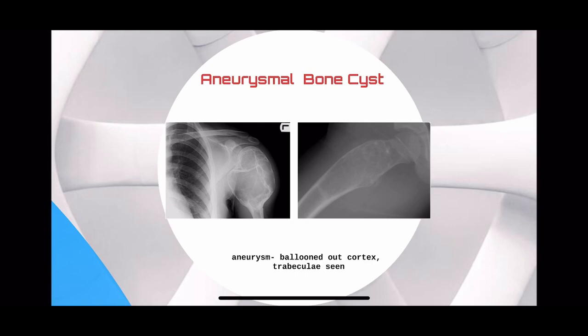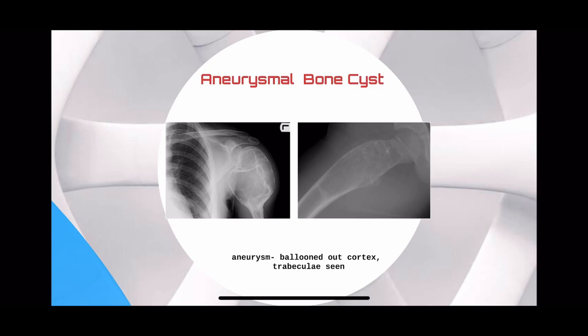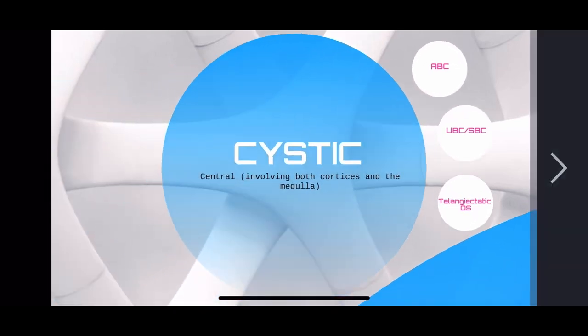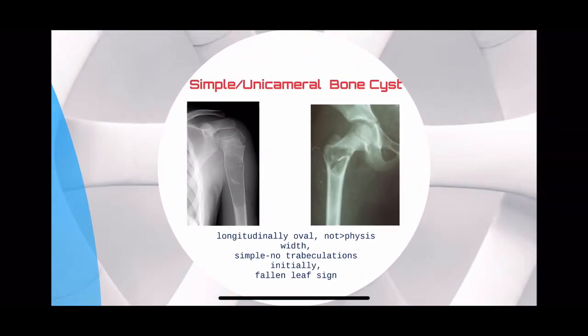There will be trabeculations like you see in a giant cell tumor. However, GCT is seen in the epiphysis while these are seen in the metaphysis or diaphysis. On the other hand, a simple bone cyst or unicameral bone cyst — the cyst is elongated and is invariably less thick in diameter than the native bone. Mostly there are no trabeculations except if there is a fracture.